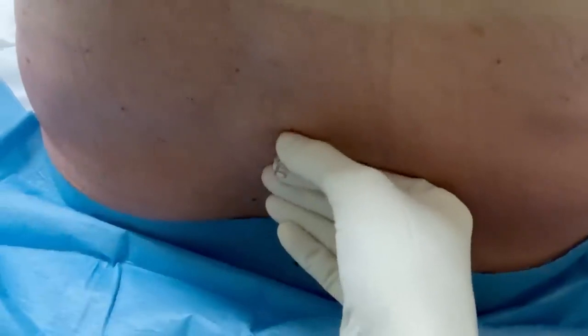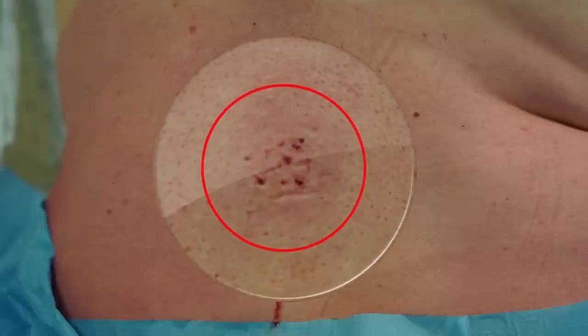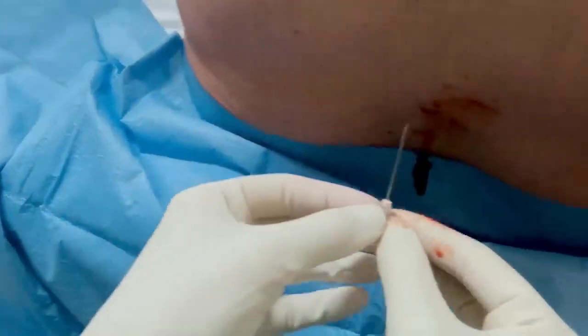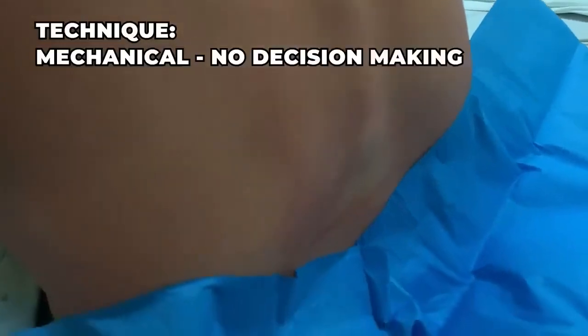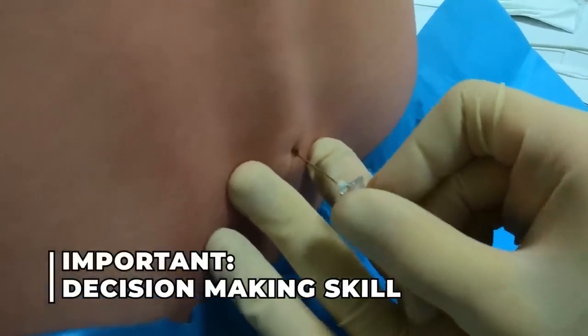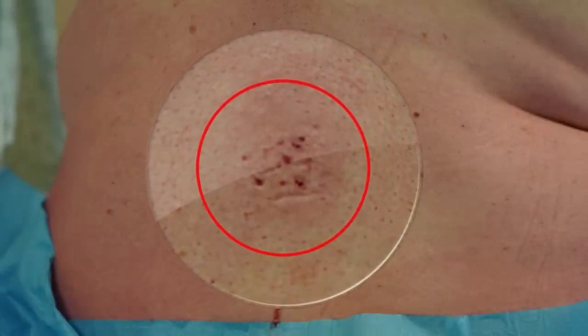Worse yet, the operator changes the needle insertion point to a new one, but only 1 or 2 millimeters away from the original attempt. When I see multiple needle insertion sites clustered within a square centimeter, I can immediately make a diagnosis that the operator has not been trained properly and does not think through the process. In other words, he or she performs the spinal anesthetic or lumbar puncture automatically, textbook-wise, without the ability to make decisions in the process.